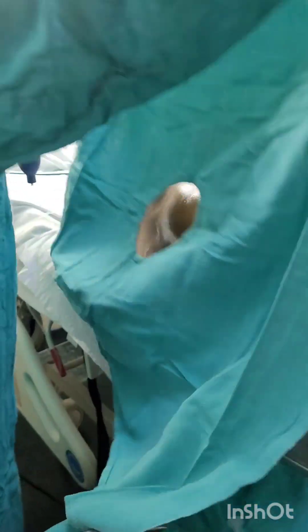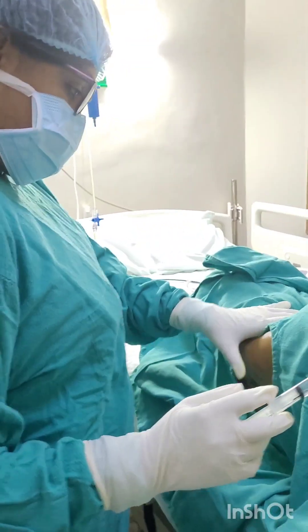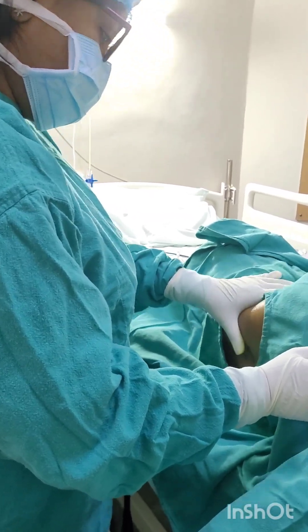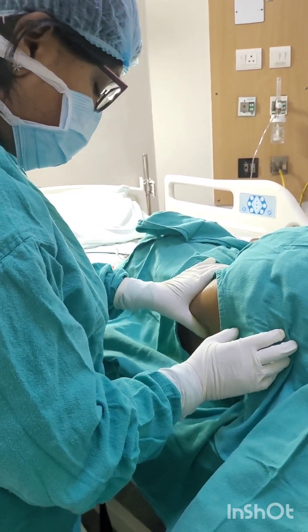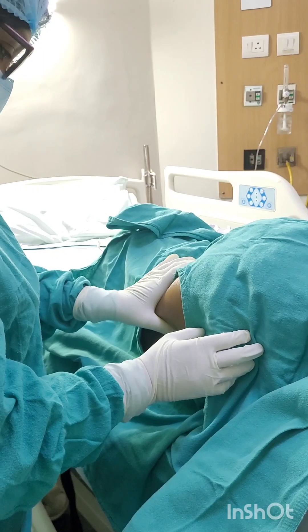Come down over the spine and spinous process — this will be at the level of L4. One interspinous space above or below, you have to pierce for CSF collection. First you will give local anesthesia.